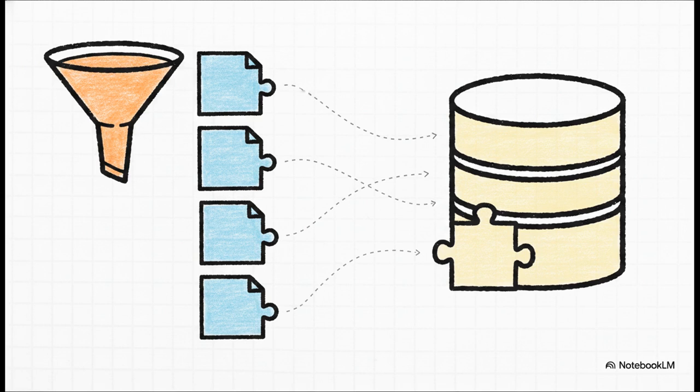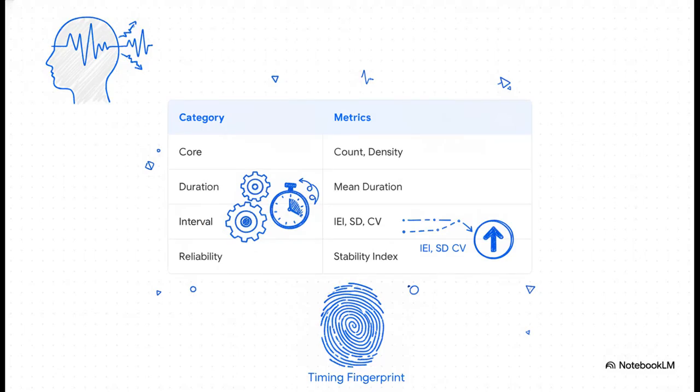But for researchers, having these formatted right out of the box as BIDS derivatives is an absolute lifesaver. It literally saves hundreds of hours of tedious manual data formatting. Because they're already standardized, they are incredibly easy to integrate directly into massive open neurodata sets and existing MNE Python analysis tools without changing a single line of code. Let's look closely at what's actually computed inside those files to summarize the brain's activity.